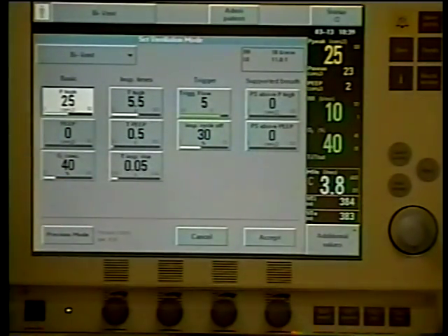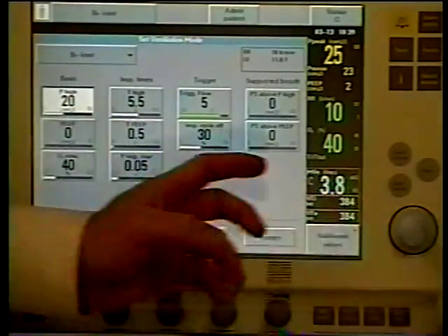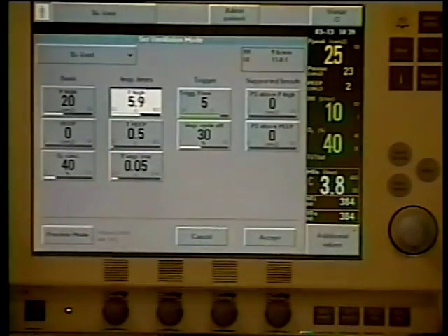So we can start dropping the P high down, and the stretch with the T high: as I stretch my T high out, what starts to happen to my number of releases? They start going down, right?